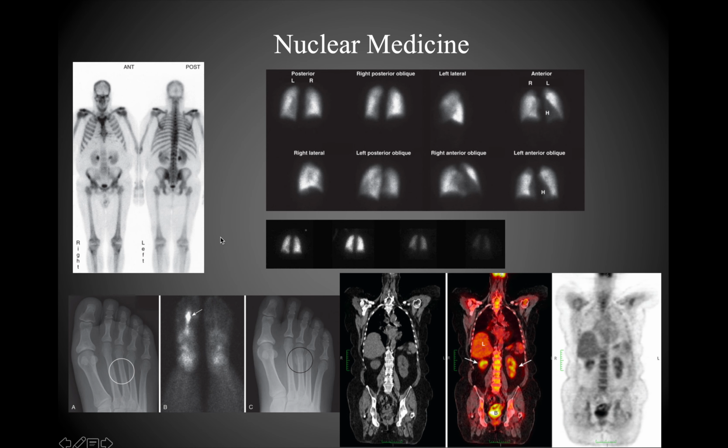We're going to conclude our videos for today with a discussion about nuclear medicine, which includes imaging studies like positron emission tomography, or PET, bone scans, and single photon emission computed tomography, better known as SPECT, S-P-E-C-T.